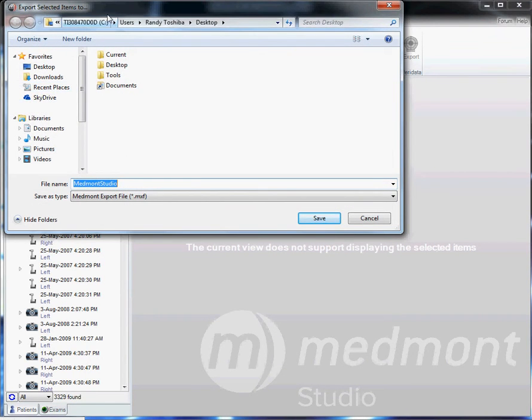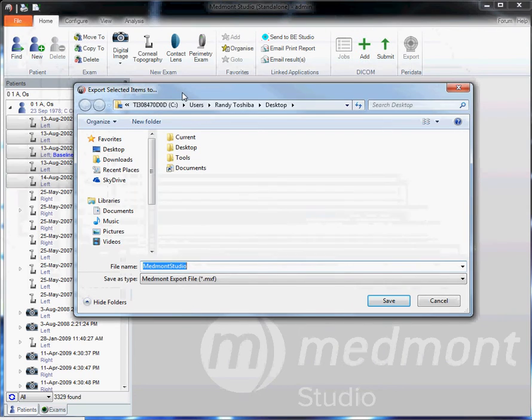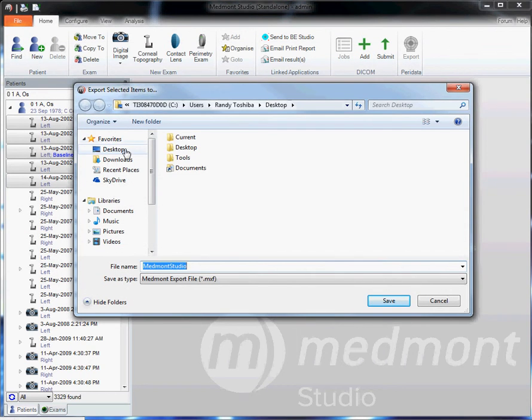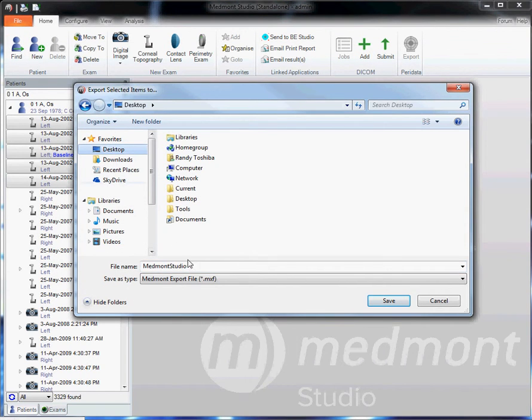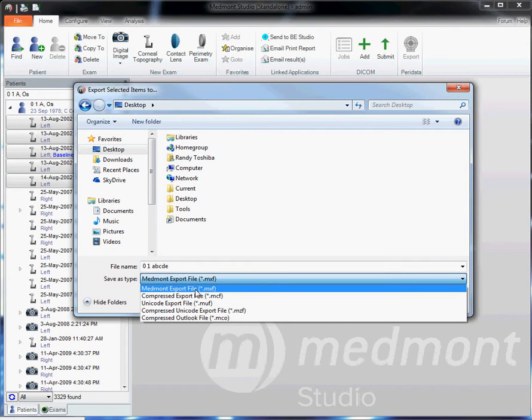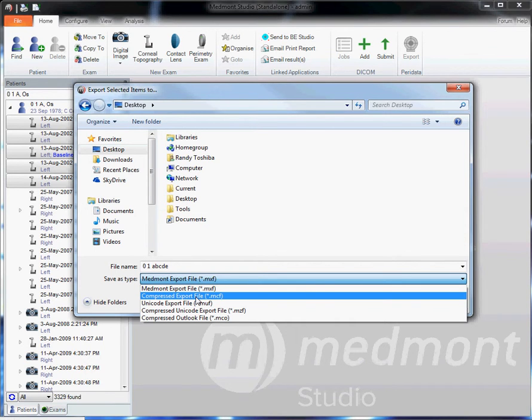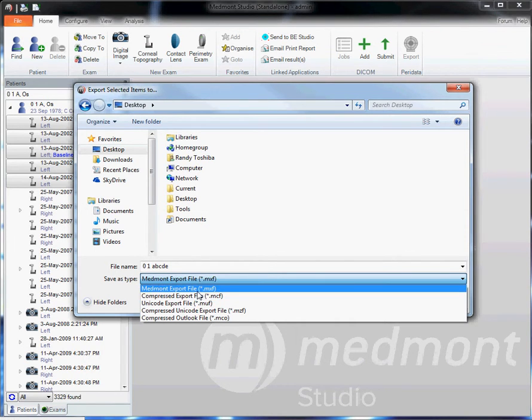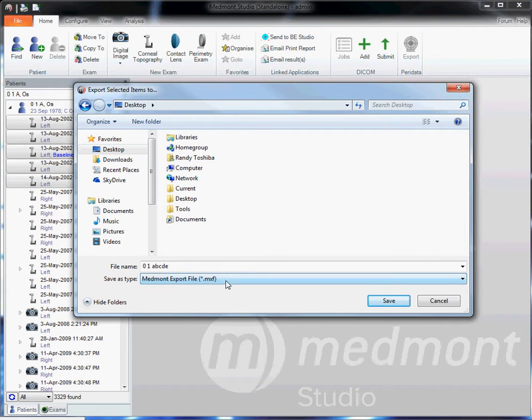Then save that file somewhere like the desktop where it's easily found. Save it as the patient name. Then under save as type, use a .mxf file for most topographies you want to export. If you need to make a slightly smaller file, then use the .mcf file. Typically, you'll save it as a .mxf.